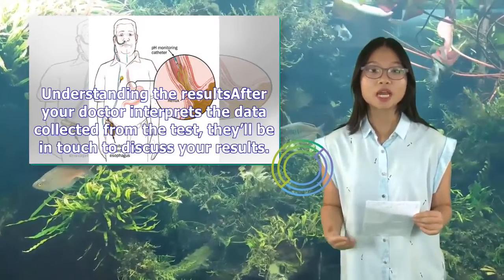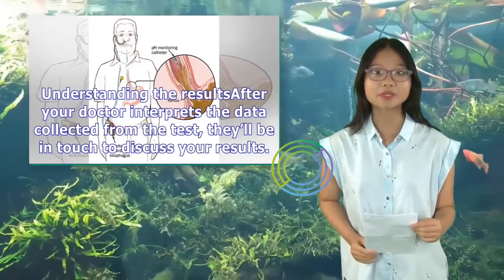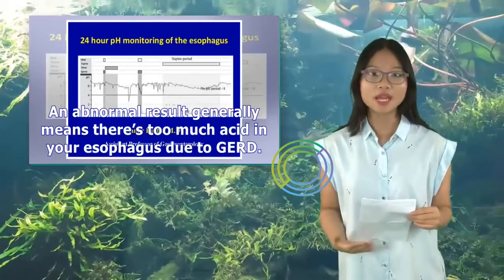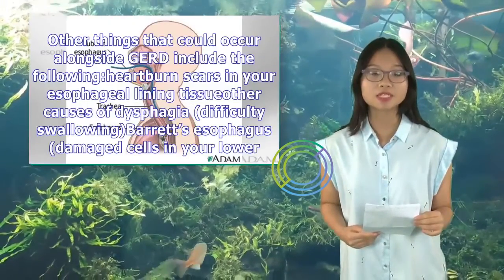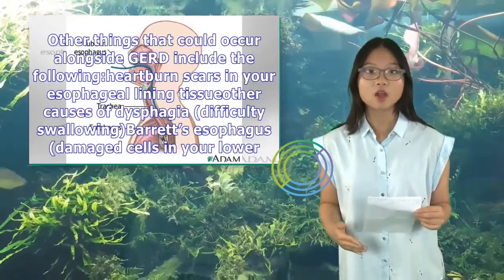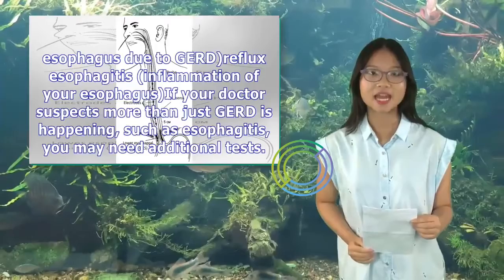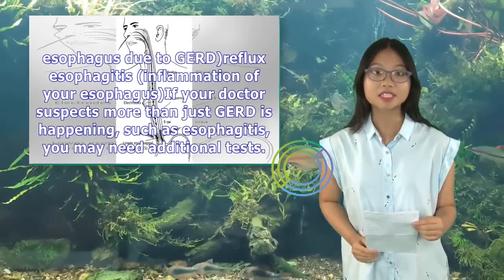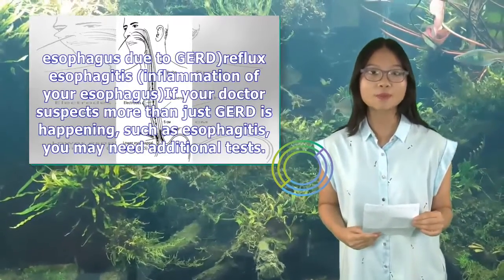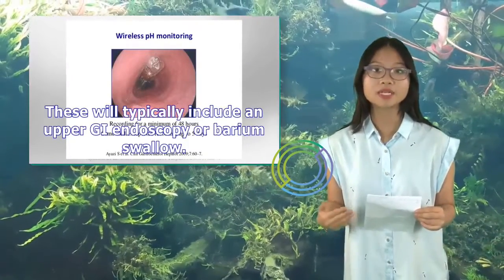Understanding the results: after your doctor interprets the data collected from the test, they'll be in touch to discuss your results. An abnormal result generally means there's too much acid in your esophagus due to GERD. Other things that could occur alongside GERD include the following: heartburn, scars in your esophageal lining tissue, other causes of dysphagia, difficulty swallowing, Barrett's esophagus, damaged cells in your lower esophagus due to GERD, and reflux esophagitis, inflammation of your esophagus. If your doctor suspects more than just GERD is happening, such as esophagitis, you may need additional tests. These will typically include an upper GI endoscopy or barium swallow.